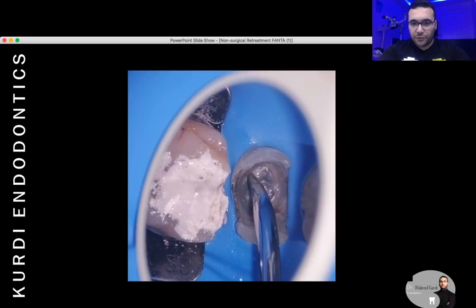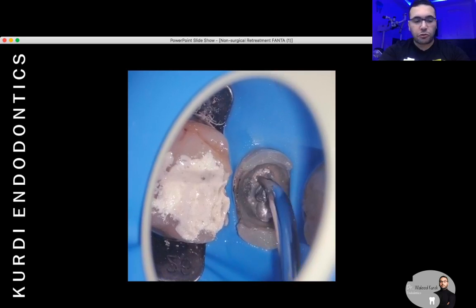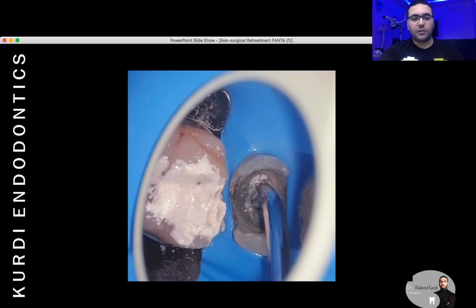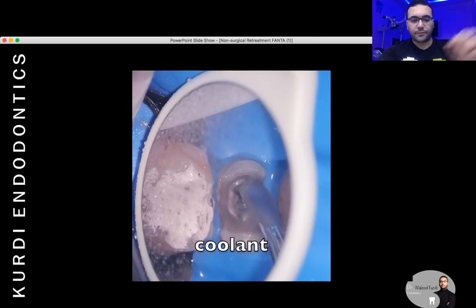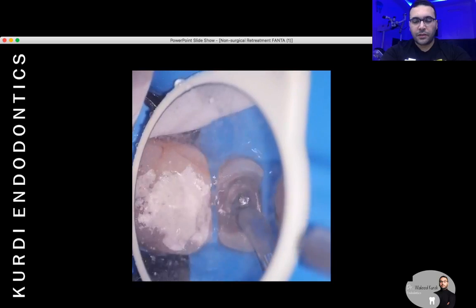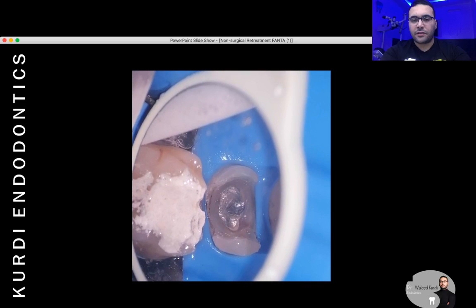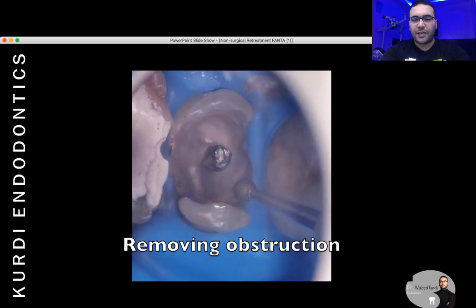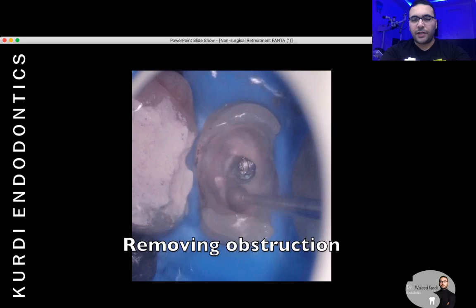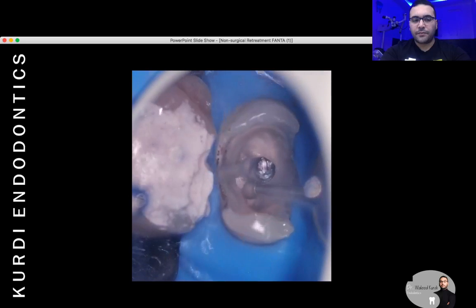Here in this video, I was supposed not to talk, just to show you in the first 5 minutes about this video. Here we have a case of a previous endodontic treatment with a periapical pathosis, and we have an abscess related to the apex of the tooth, and it was endodontically treated.